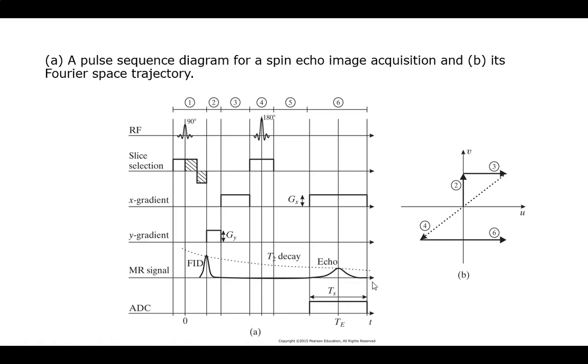It's useless. Right? In general, unless you're reading on a diagonal, and you're almost never reading on a diagonal, you're only going to have your readout, the ADC, analog to digital converter. You're only going to be doing your sampling with your X encoding. Right? Why not do all my encoding and then read out?